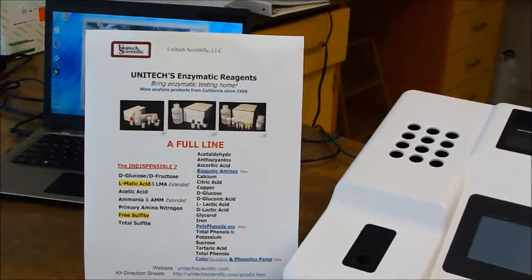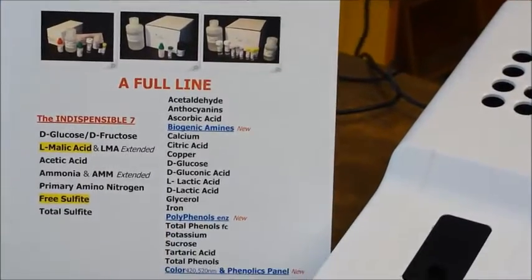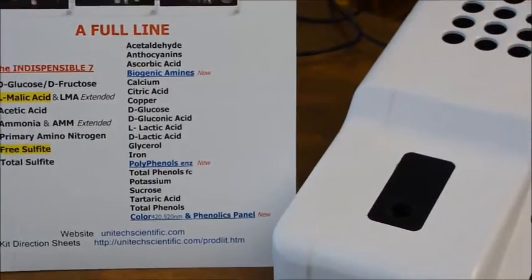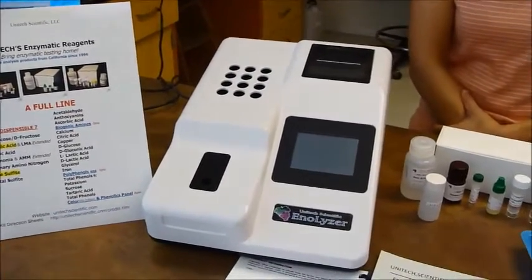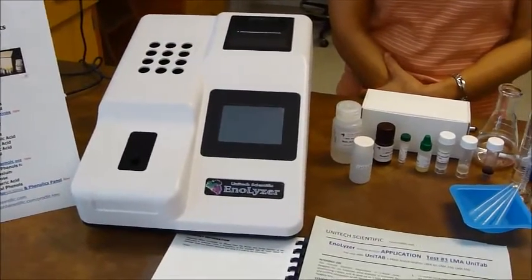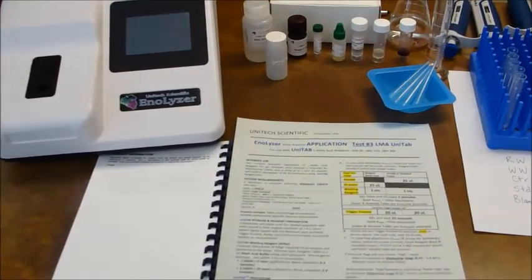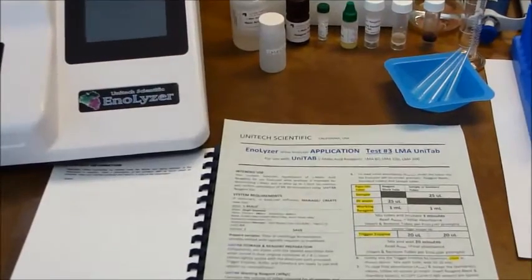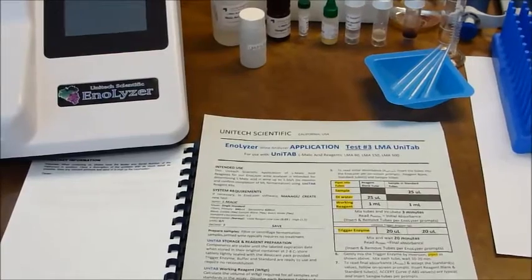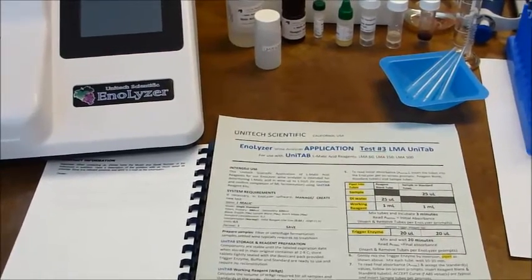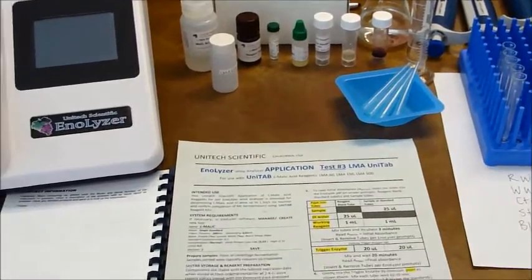Today we are demonstrating Unitec Scientific's Enalyzer Wine Analyzer, a batch analyzer, to test wine samples for both malic acid and free SO2. As part of this demo, we'll show the use of the StatFax Capture software on our PC to create a text file of our Enalyzer data. We're using Unitec's malic acid Unitab reagent kit to test two wine samples, and we're including a control to monitor our assay performance.